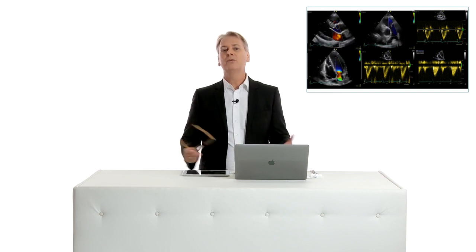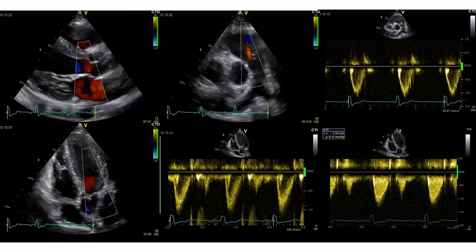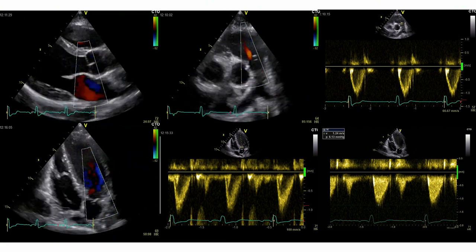And even when color Doppler came around the corner, many people said, well, what do we need that for? Now we have spectral Doppler. Today, we use both spectral and color Doppler in a routine exam in many imaging positions. And that's exactly what I'm going to show you in this presentation. Before I show you where we use color Doppler, let's take a look at the settings first.